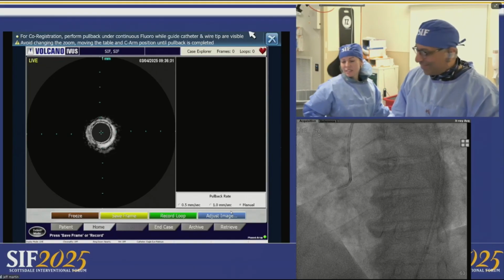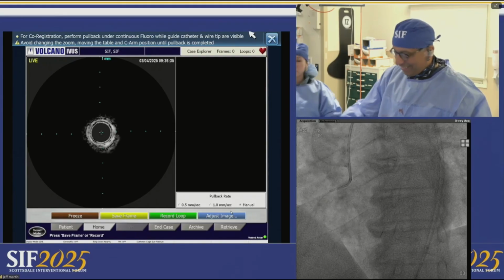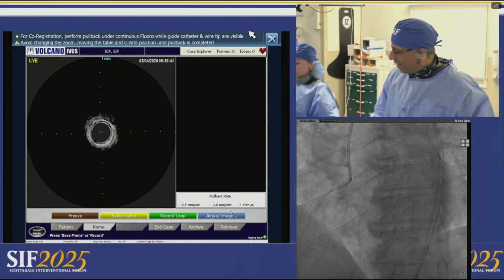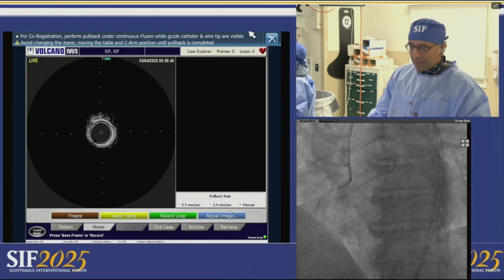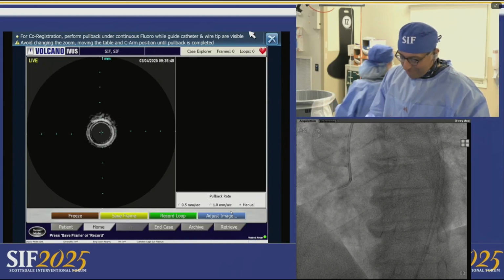How can I even see what's going on? I'm going to also throw you the bone, which is that what he's using is better than not using IVUS. And at the end of the day, all you need to know on IVUS is how big should I make the stent, and do I need to do anything more about calcium? All the rest of the discussion is a discussion.